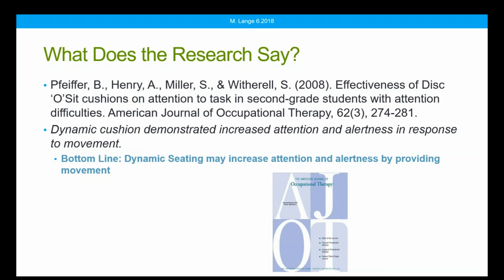Some of the same researchers in 2008 did another study on those disco sit cushions, those little circular air cushions that sometimes are used in schools on top of a standard classroom chair. They found that attention improved. So this is yet another study that shows that dynamic movement can increase attention and alertness. And I have seen this in my own practice. I have a number of colleagues who have noticed that once clients are provided with movement, alertness definitely increases.